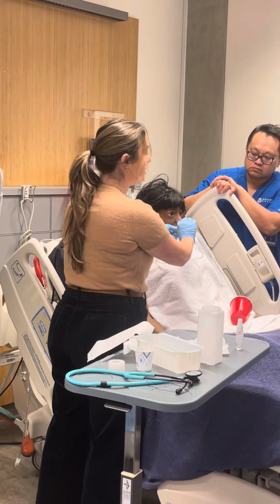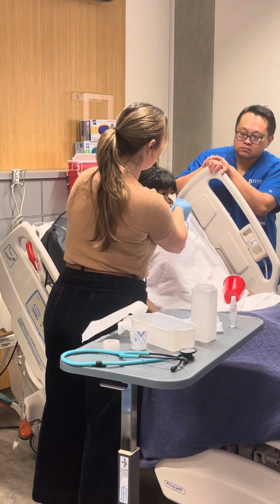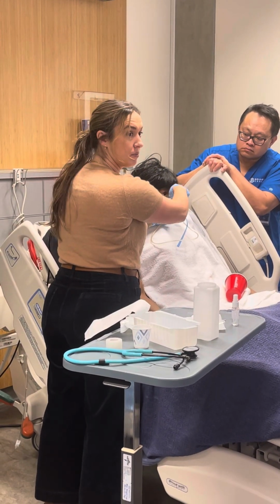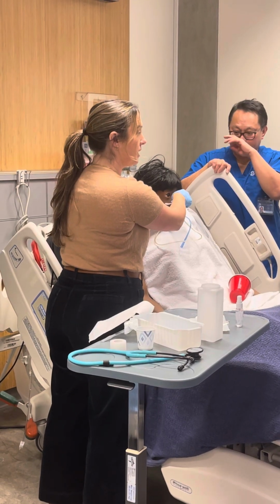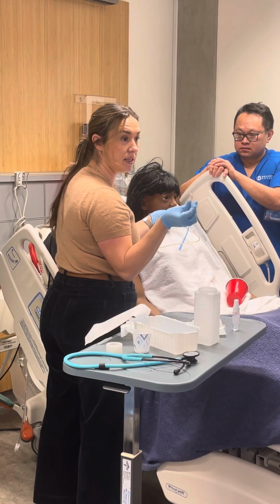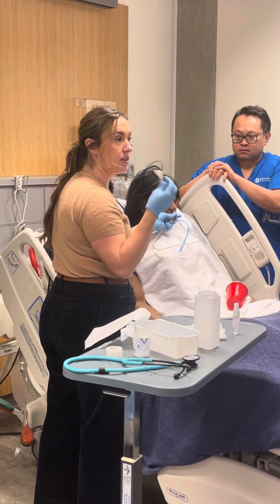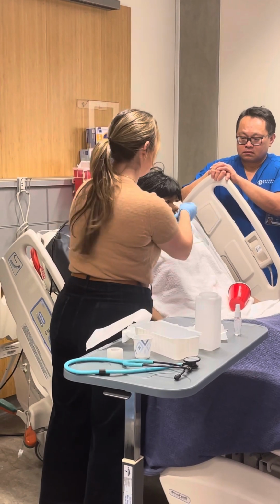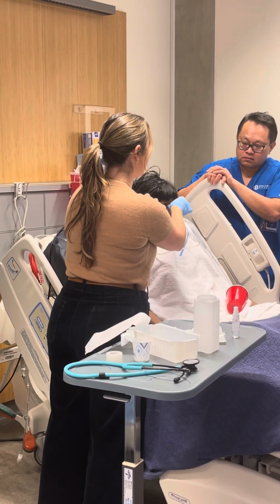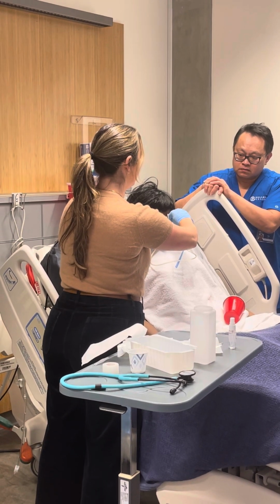For this guy, it looks like a little bone. The top part of the bone goes on the nose right here. We're gonna put on the skin protectant. The skin protectant is gonna prevent skin tears, and it's also gonna make it a little bit stickier so that these don't pop off. People's faces get sweaty, and these kind of come off easily, but the skin protectant helps with that. So you're just gonna put it on like this, and then pull this part off.